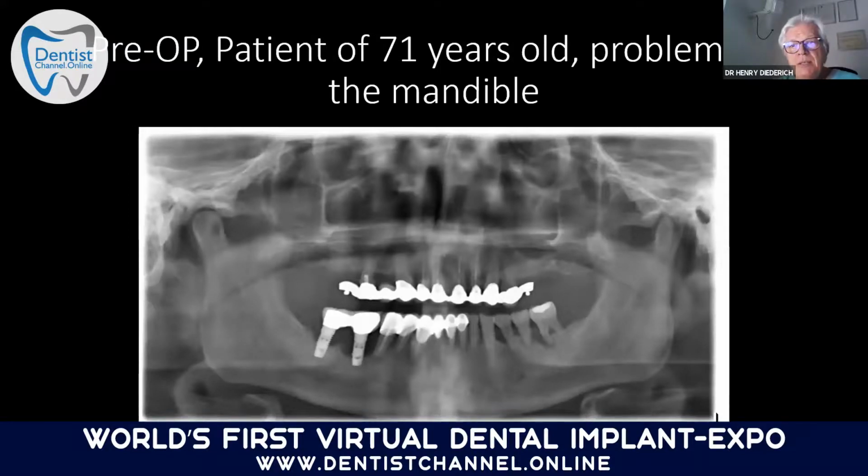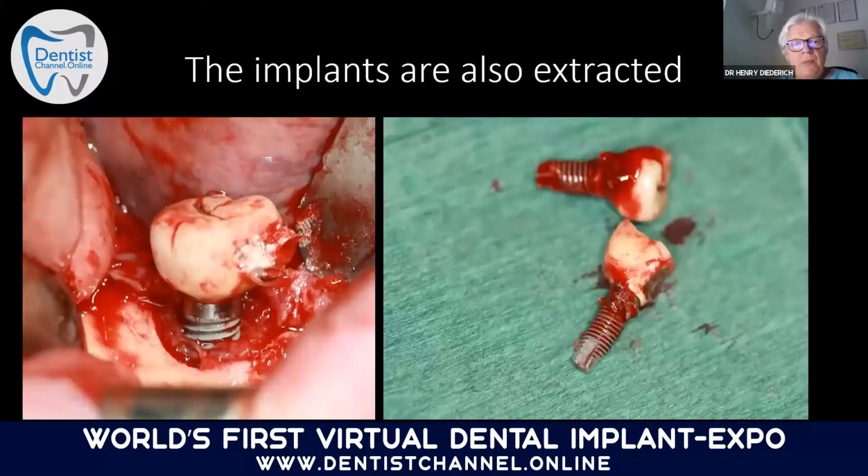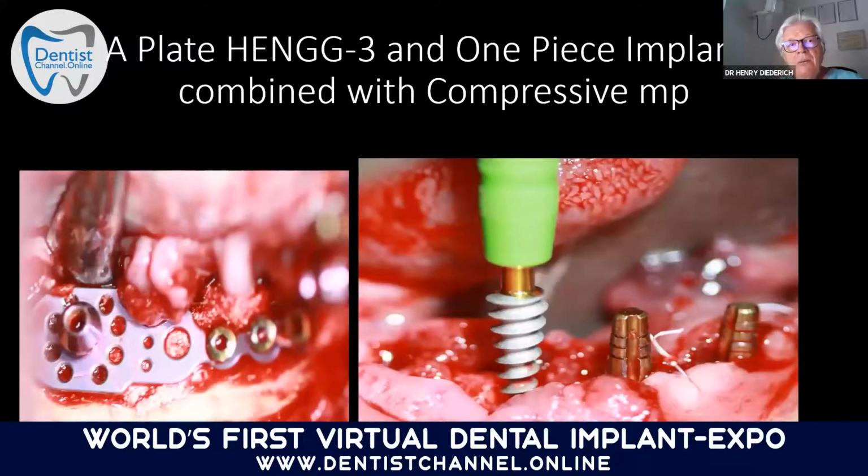Another patient, 71 years old, had problems in the mandible. Of course, you know, we have different treatment options. Especially here on the left side, there was peri-implantitis. We took out all teeth. You may imagine, the implants were also extracted. We put a plate and compressive one-piece implants.